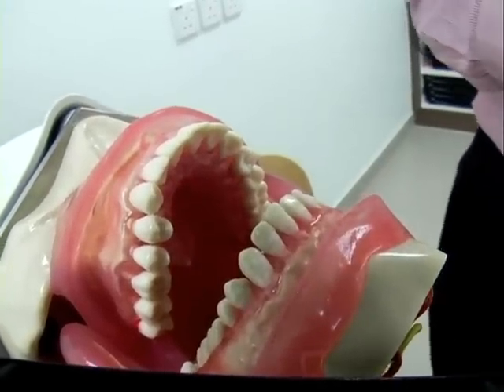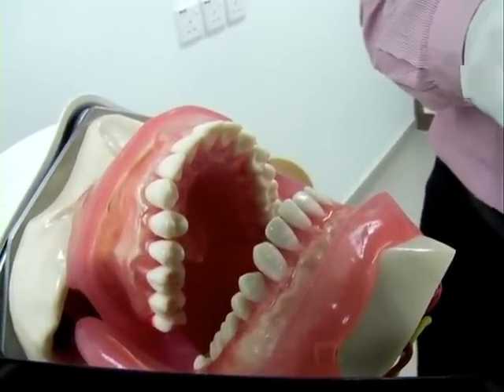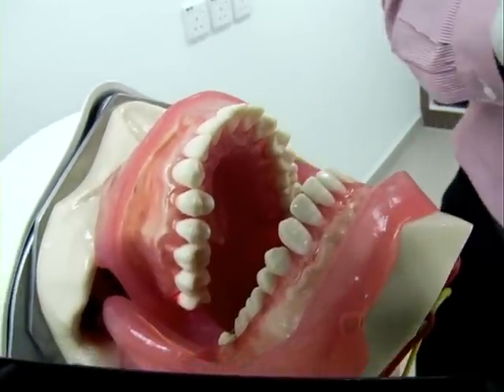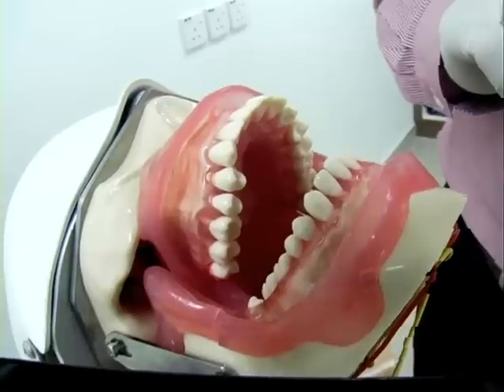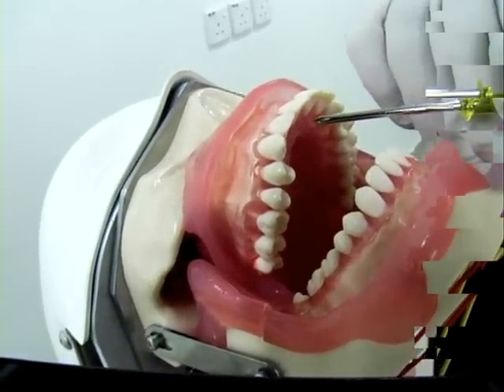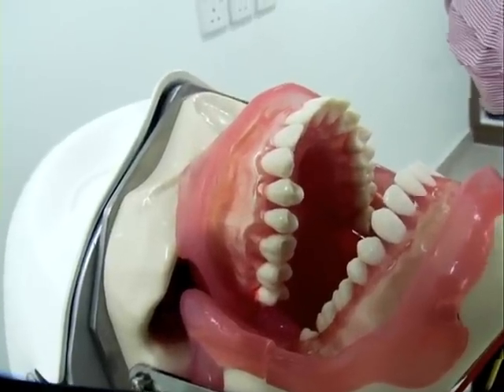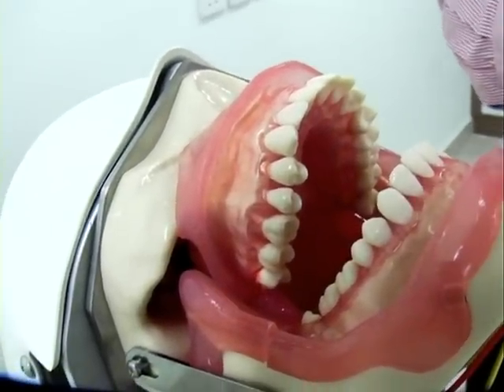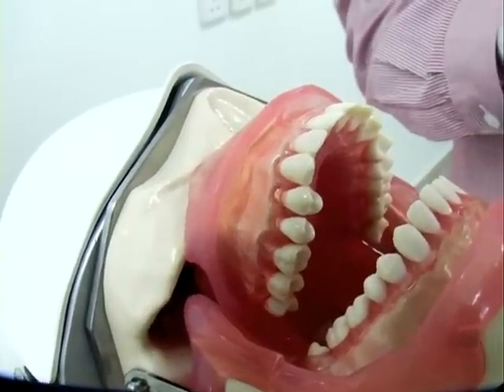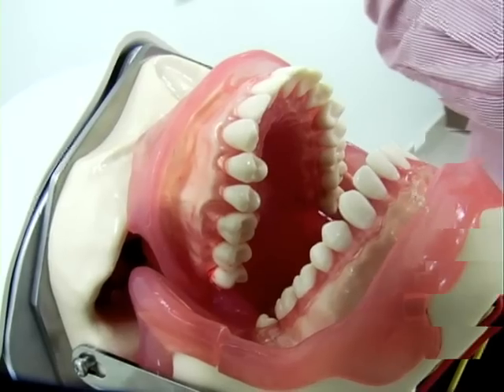We are going to show you a video demonstration on infiltration. Here is the mannequin model. You can see that there are different areas which we are going to show you on the skeleton as well, which are important in terms of infiltration. We are going to switch quickly to the other model, which is an osteology model.